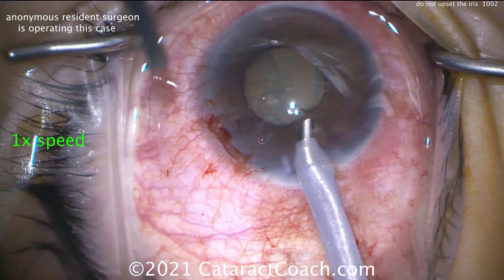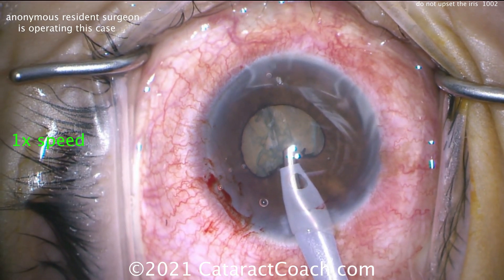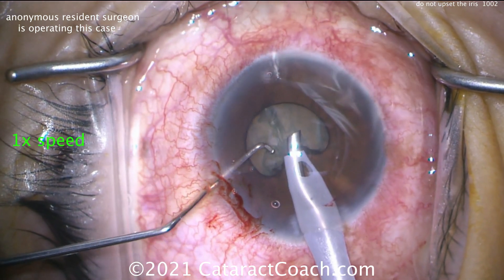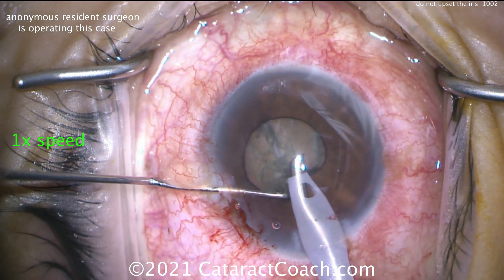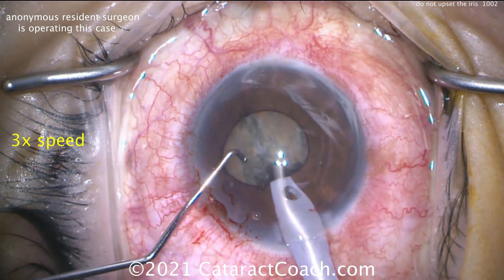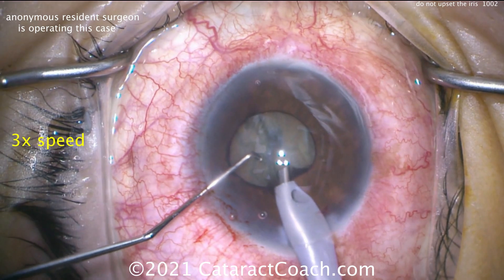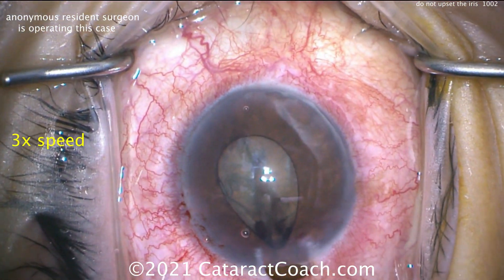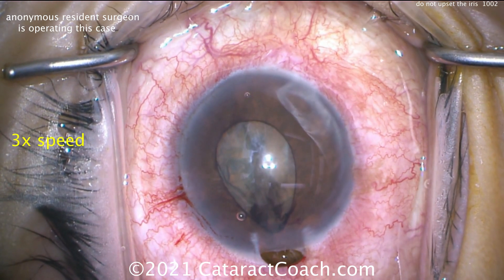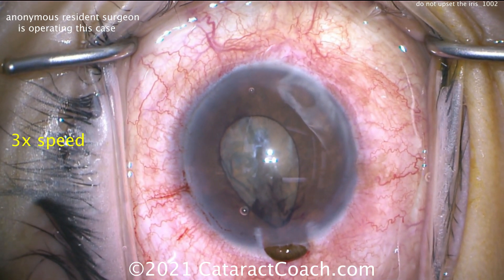Here comes the resident with the phaco probe, right hand going inside the eye — let's slow it down. Oh, why are you touching the iris? Don't touch the iris! That's a problem — you just made the iris really upset. You can't touch the iris like that because that's going to cause more miosis. That pupil's going to constrict. Now you are in a world of hurt. You shouldn't have touched the iris. Anytime you touch that iris — look at that prolapse — this is going to be a hot mess. You're going to get a small pupil very soon. This started off as basically a routine case and now it's going to be a punishment.